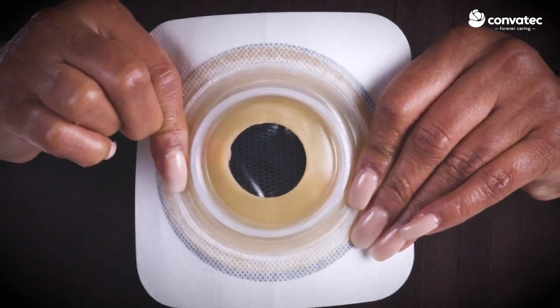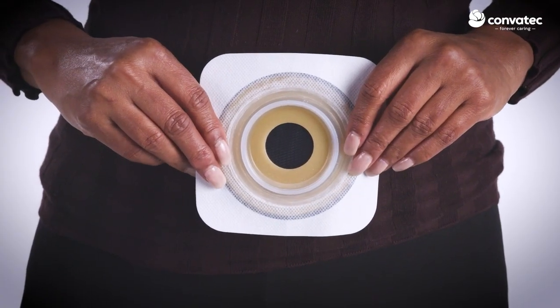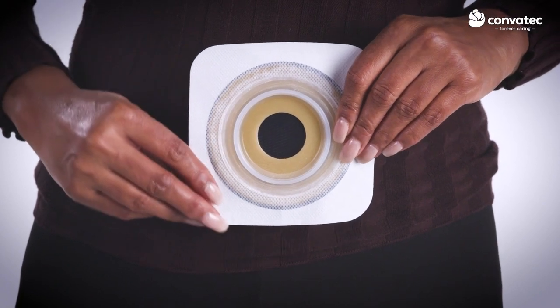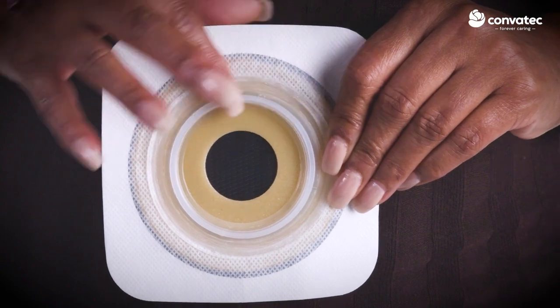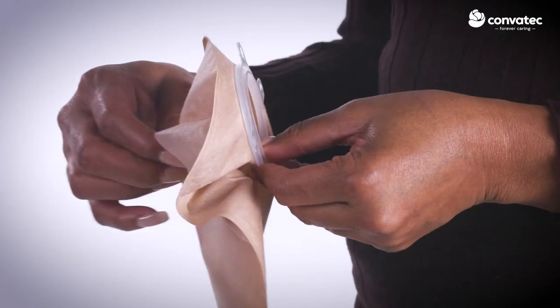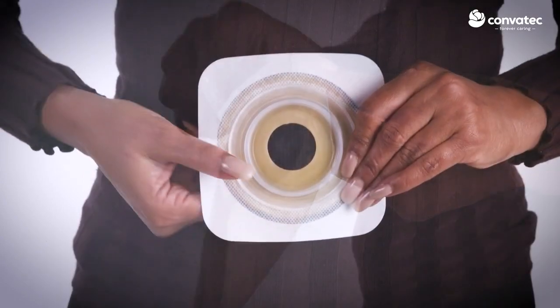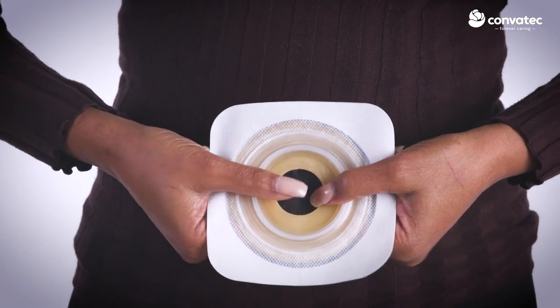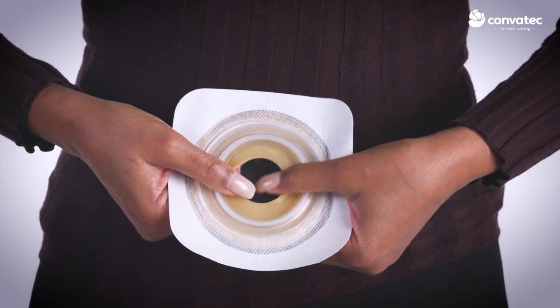It has a flexible collar, which provides an extra level of security and flexibility. Next, you'll see a plastic coupling ring, which is used to attach the pouch to the base plate. The coupling ring on the base plate should match the size of the coupling ring on the pouch. Finally, the circular opening in the center of the base plate is the starter hole. This is where you will begin the moulding process.